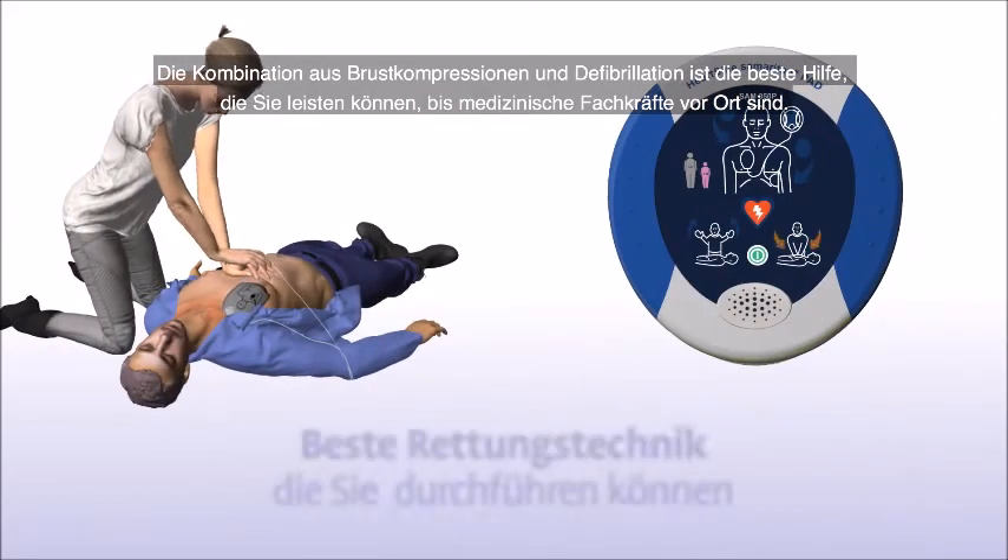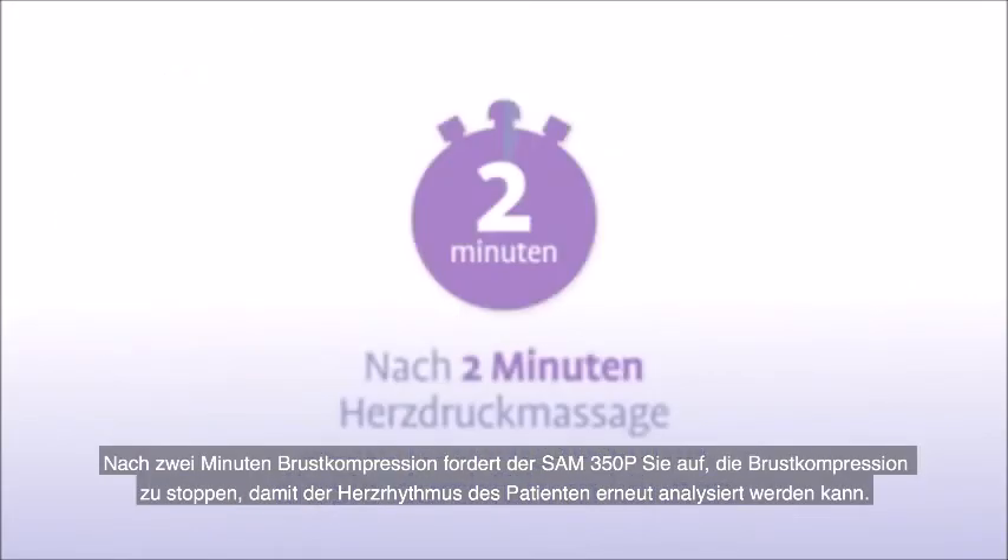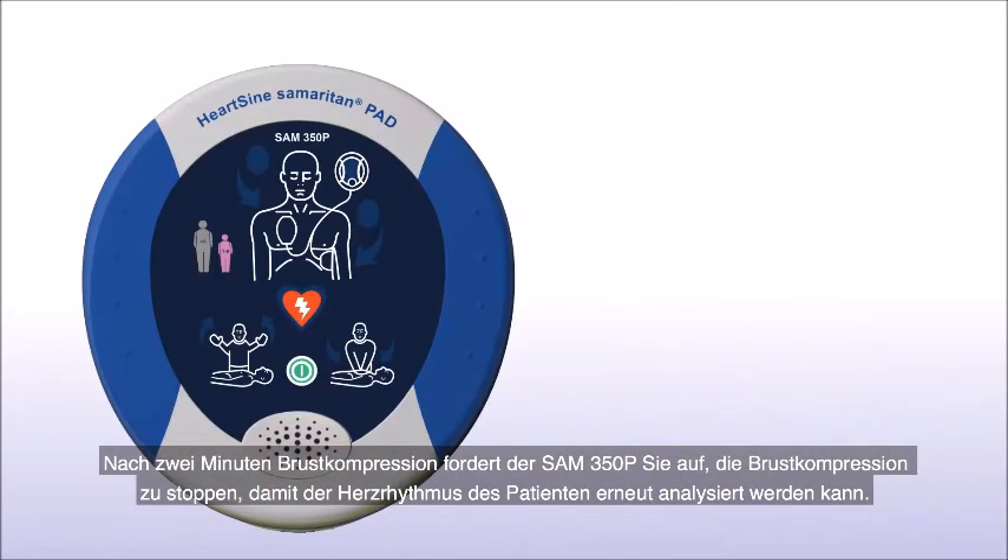The combination of chest compressions and defibrillation is the best treatment you can provide until medical professionals arrive on the scene. Once you have completed 2 minutes of chest compressions, the Sam 350P will prompt you to stop chest compressions and again assess the patient's heart rhythm.